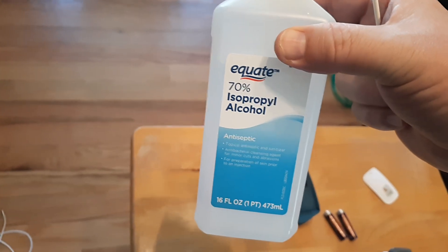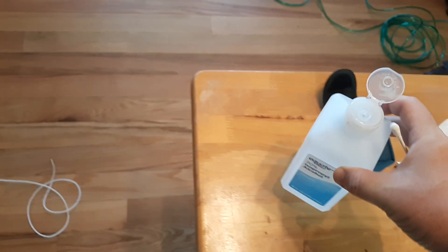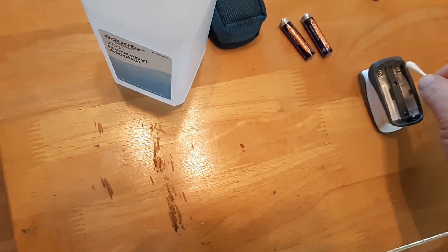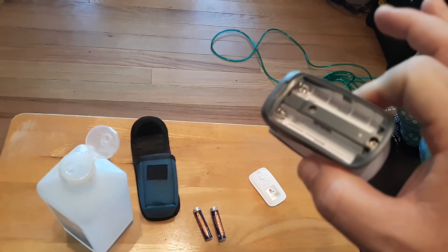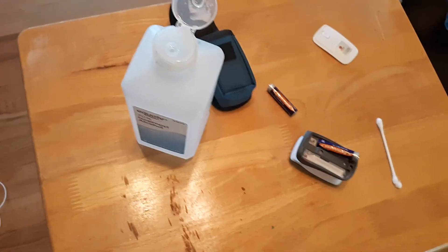This is isopropyl alcohol — it doesn't matter if it's 70%, 90%, whatever you have. Lightly apply the isopropyl alcohol on these battery terminals, go underneath and to the sides, and let that dry. Give it a good 30 minutes to dry, then reinsert your batteries and see if it works.